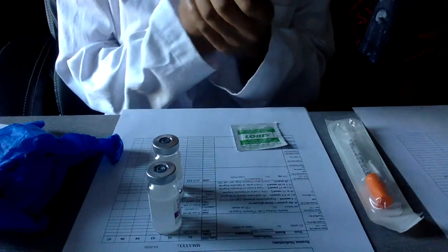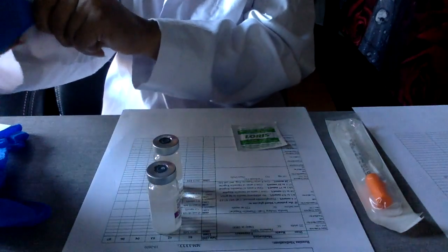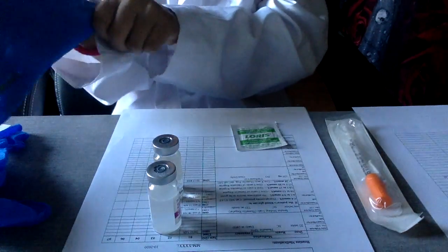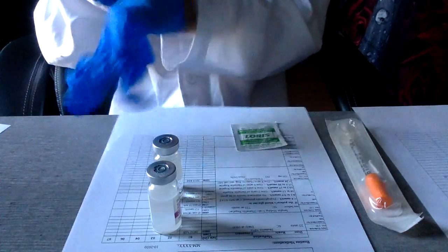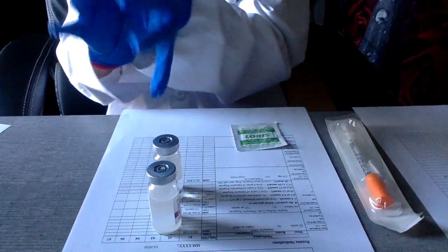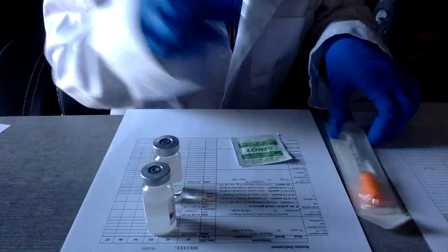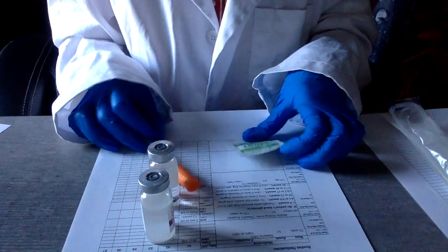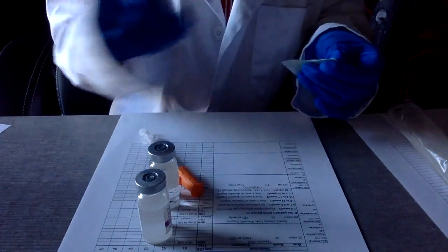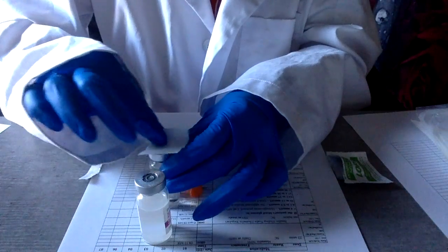So I do hand hygiene, put on gloves, and the next step I would take a syringe. Then I will wipe the top of the 2 vials for 5 seconds to prevent germs. Let it air dry.